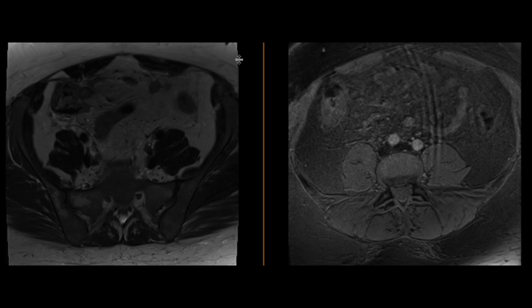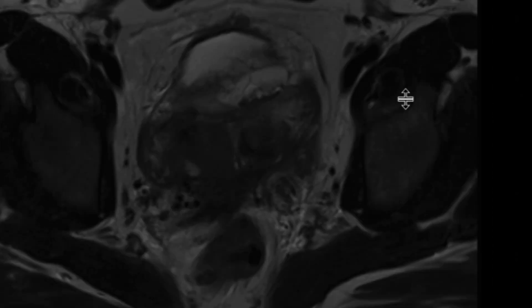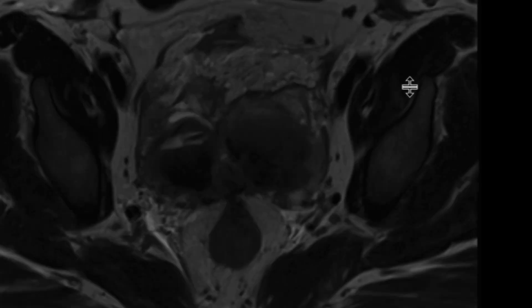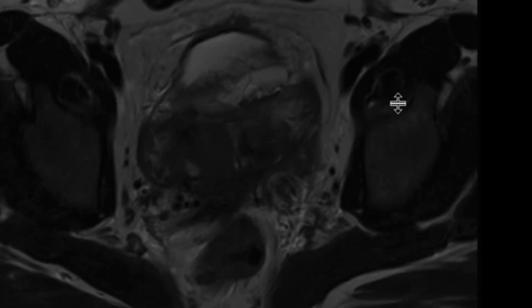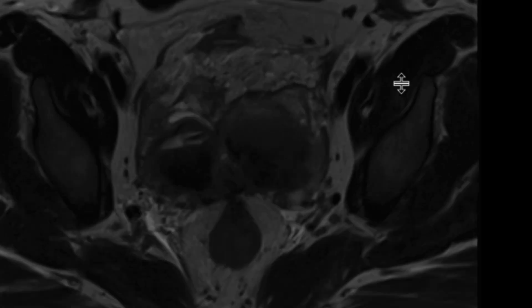This is a patient with pelvic pain, and a pelvic MRI was performed to further evaluate this. On the T2-weighted images, we can see there are a lot of abnormalities in the pelvis. If we look at both adnexa, both ovaries, there are bilateral masses.